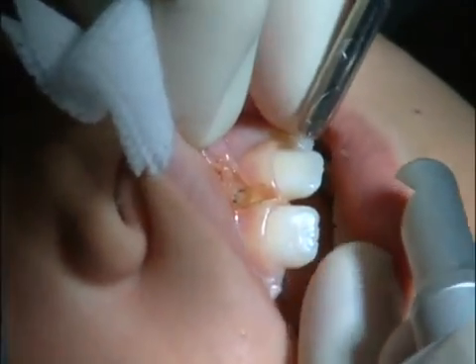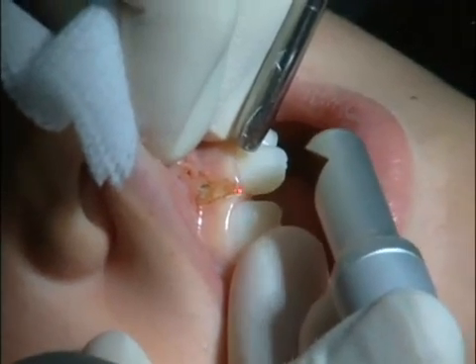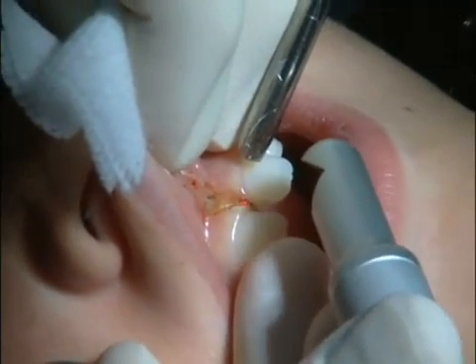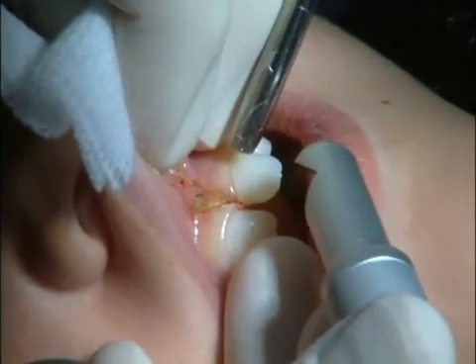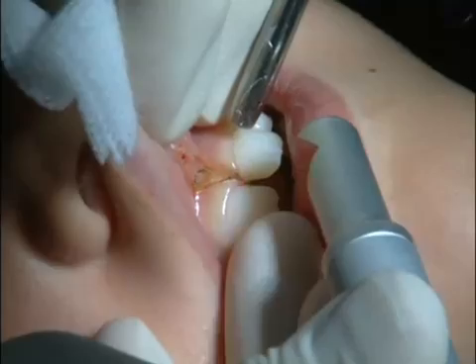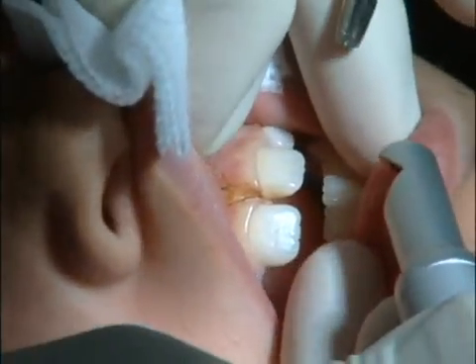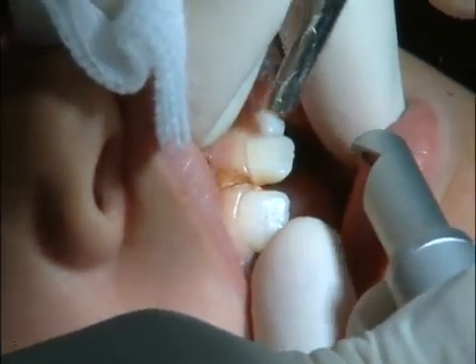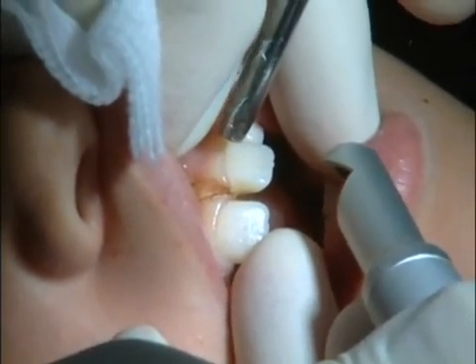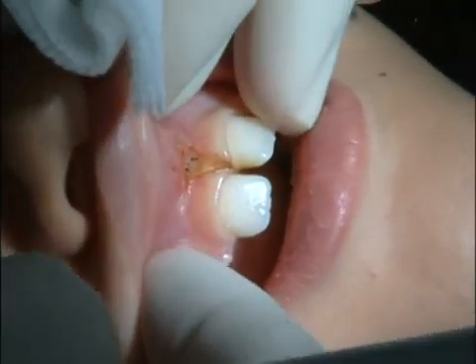Now I'm going to come back here, open really big, and I'm going to dehydrate a little right up along in here and take it back. Open really big again. And now I've taken it back between the teeth.